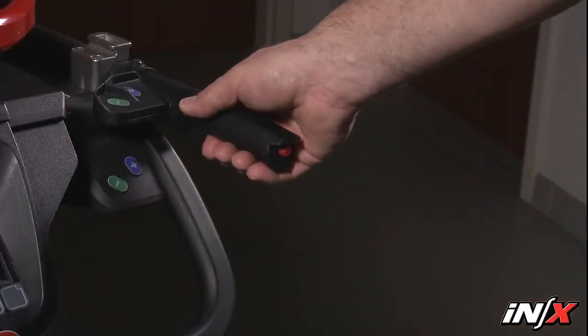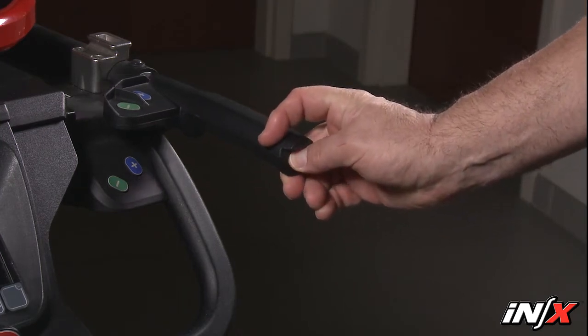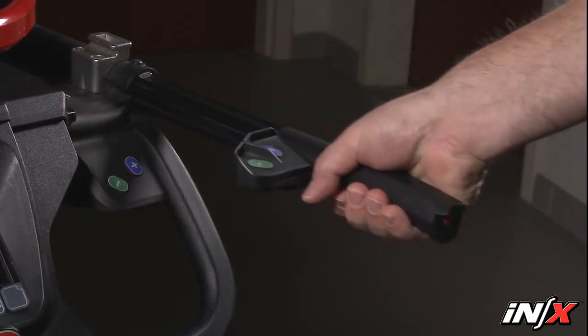The telescoping handles are useful when rolling and maneuvering the NX. The handles have two positions: fully retracted or fully extended.